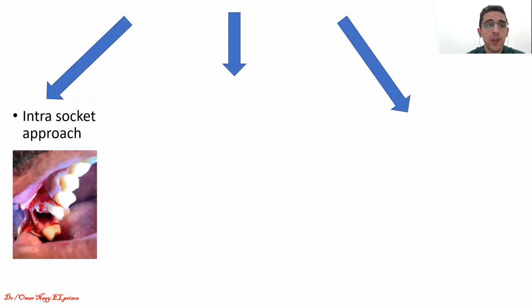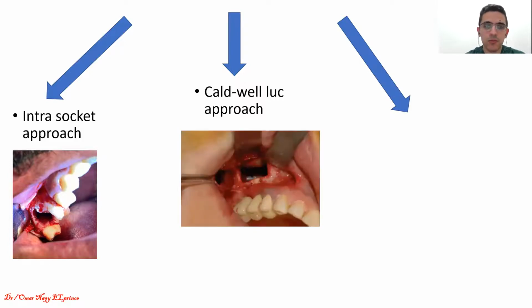Okay, we have to consider that the intrasocket approach is not always a feasible treatment modality, it's not always a good approach just to retrieve an implant. بعدين عندنا Caldwell-Luc approach which is the most commonly used one. ده أكتر حاجة بنستخدمها علشان نحاول إن إحنا نريتريف الإمبلانت من الماكسيلاري sinus.